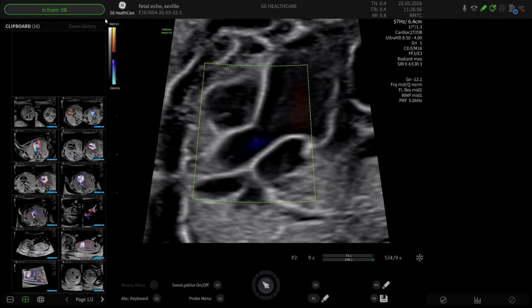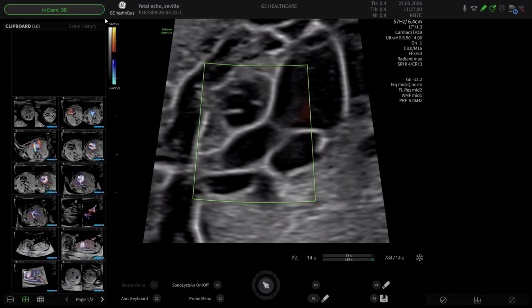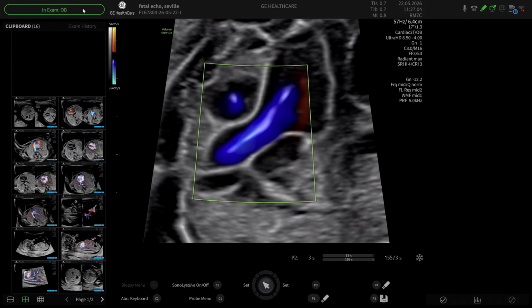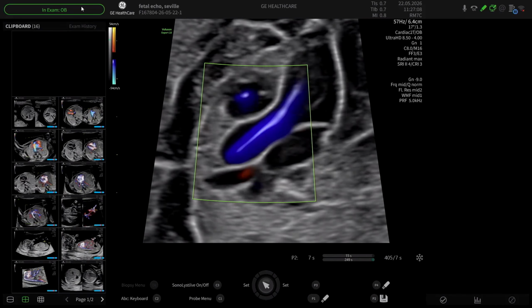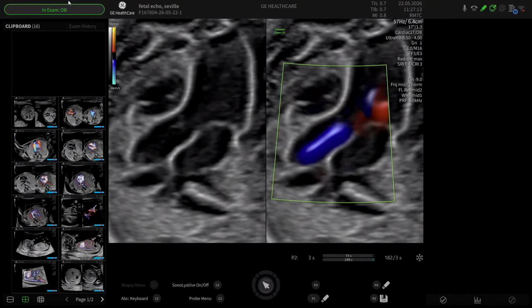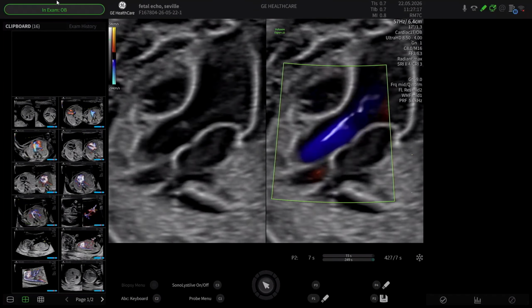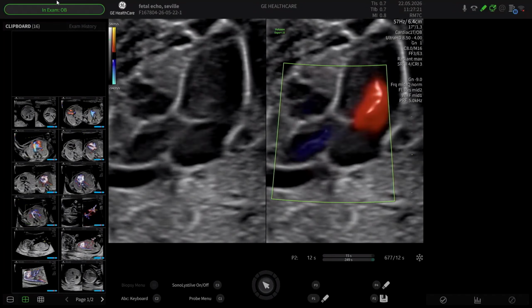So my next thing is I look in the top right-hand corner and I see my output is I can afford to increase it. So I'm now increasing my output. And then my last control then is to increase my gain. Once I have all those settings, I can then compare a 2D and color side by side. I can also change my radiant to max. And this is how Reem produced those beautiful images, which he demonstrated, by using those controls, exactly what I've just described.